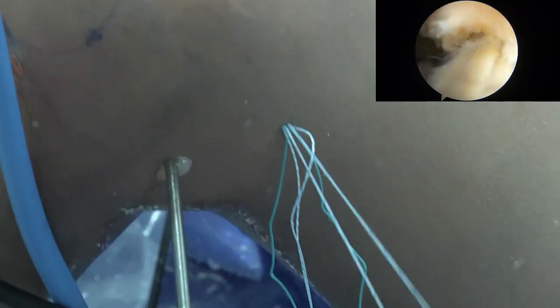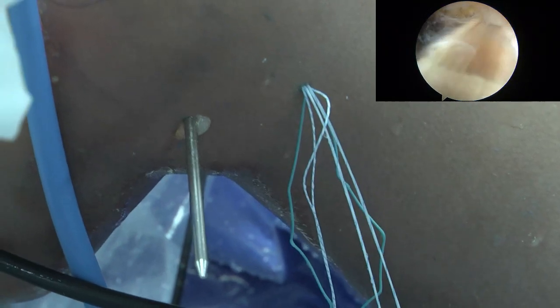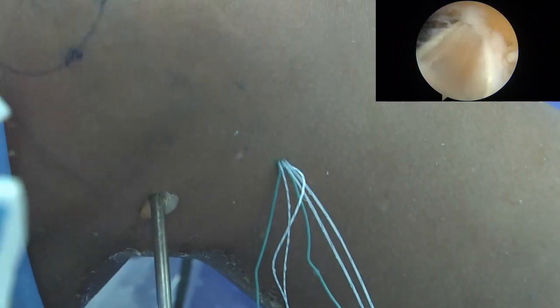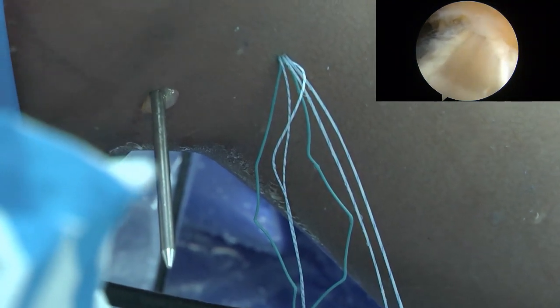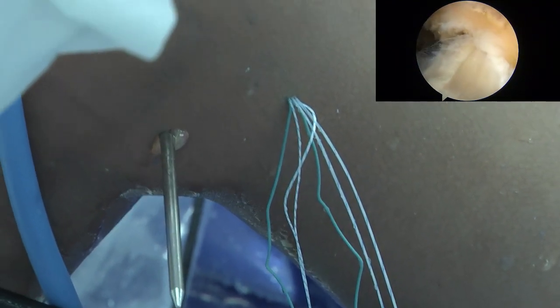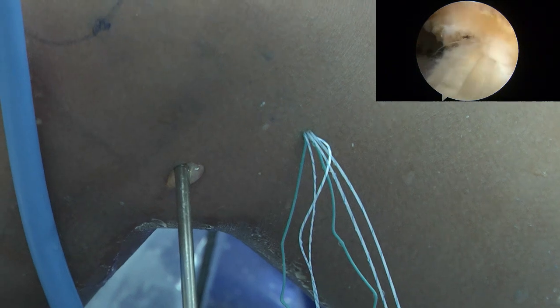Yeah, very good. Get in, right? Okay. Very good. And it will stuck. You cannot go further because this is like the blind tunnel. It's like a cave. So the end of the cave is sitting. The graft is sitting there. So you cannot pull further, it is stopped by the tunnel.